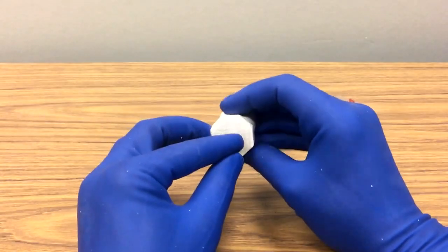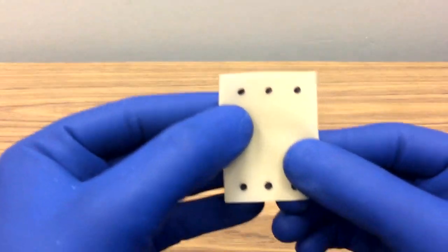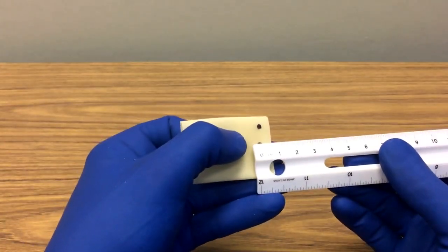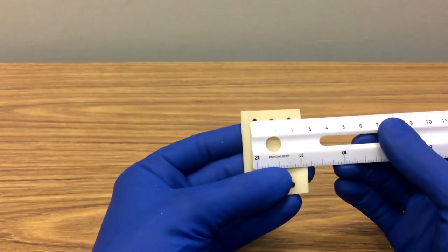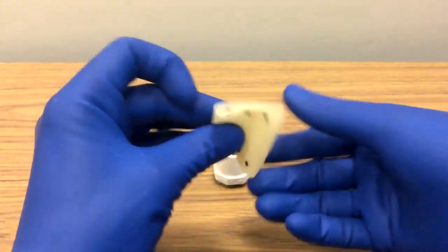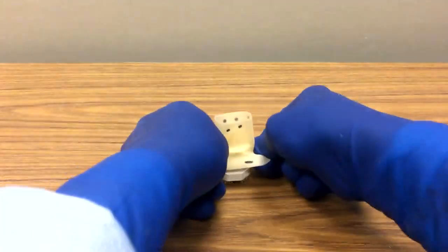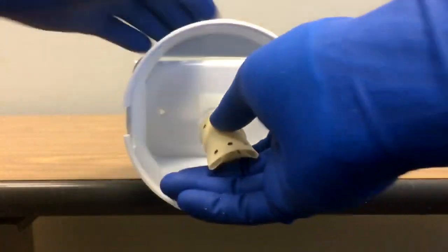For task 4, a square fastener is attached to the 3/4 inch plug, and a 1 inch Penrose drain is cut to 5 centimeters. A 2 millimeter wide dot is made 7 millimeters from the edge of the drain at its midpoint. Two additional dots are placed 1 centimeter away on either side of the dot. Dots are placed in a similar fashion on the underside of the drain, and the drain is placed over the plug. For this task, the insert is simply placed into the model.